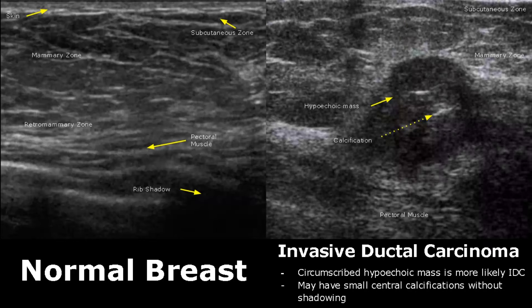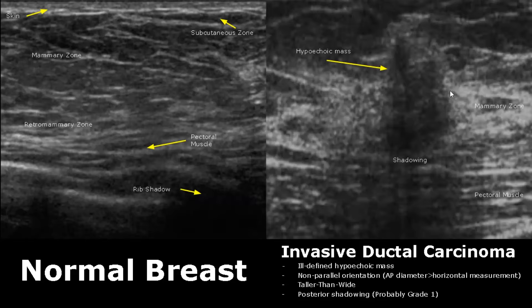Invasive ductal carcinoma is the most common form of breast cancer and has variable appearances. One appearance is a circumscribed hypoechoic mass with some calcifications. Another case shows an ill-defined hypoechoic mass with a non-parallel orientation — taller than wide — where the AP diameter is more than the horizontal measurement. It also has posterior shadowing, which is usually a sign of grade one invasive ductal carcinoma, though not always.